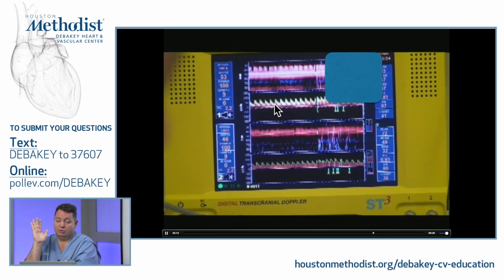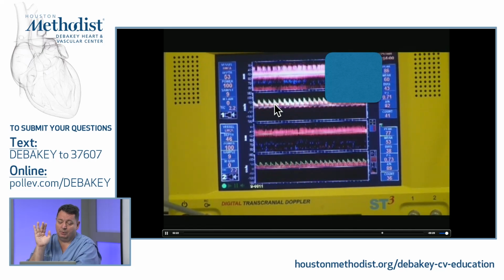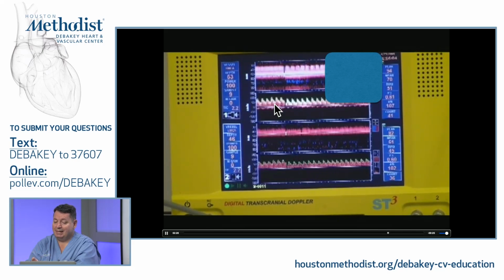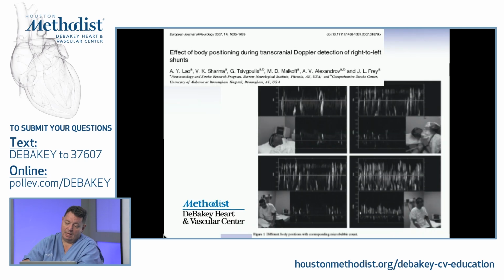Another assurance is you put something on the back of the patient, to make sure they don't fall backwards. So I'll have a comfy chair or put them back on the wall. And this is where we would repeat the Valsalva a few times. Make sure the air clears out from the circulation. This is another one. I will go back to that one. I just wanted to emphasize one more thing.